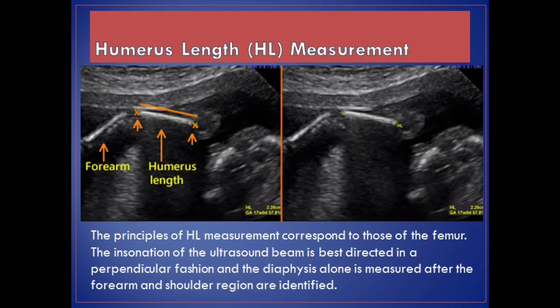Humerus length, HL, measurement. The principles of HL measurement correspond to those of the femur. The insonation of the ultrasound beam is best directed in a perpendicular fashion and the diaphysis alone is measured after the forearm and shoulder region are identified.